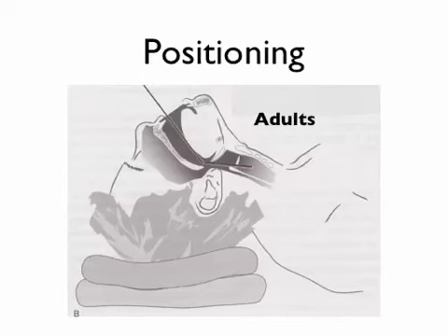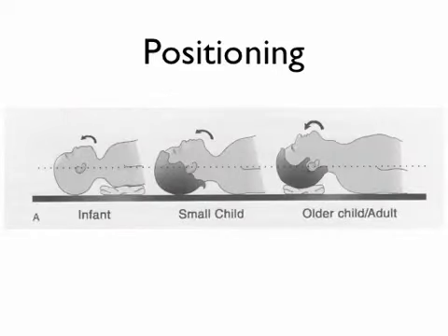When we come to intubating children, there's a few differences to the way we set up for adults. In adults, we tend to elevate the head on a pillow or some folded up towels to try and get them into the optimal position for intubating. Whereas children, particularly infants and young children, tend to have quite a large occiput, the back of their head is relatively large and will tend to flex their neck forward. So you generally, in small kids, don't need to support the head too much, and in fact sometimes you may even need to put something under the shoulders. As I said before, as they get older, then they progress more towards the adult situation.